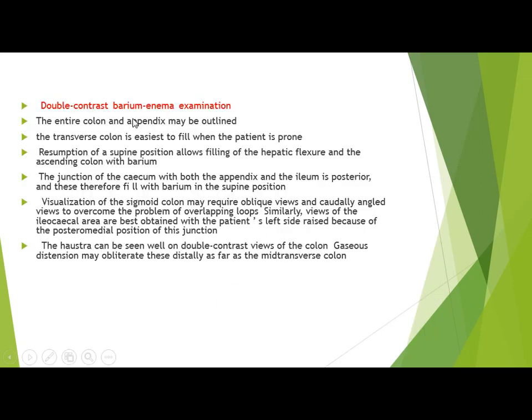Double contrast barium enema examination. The entire colon and appendix may be outlined. The transverse colon is easier to fill when the patient is prone. In the supine position, the hepatic flexure and the ascending colon will be easily filled. The junction of the caecum with both the appendix and the ileum is posterior, so the supine position is good to fill these two structures.